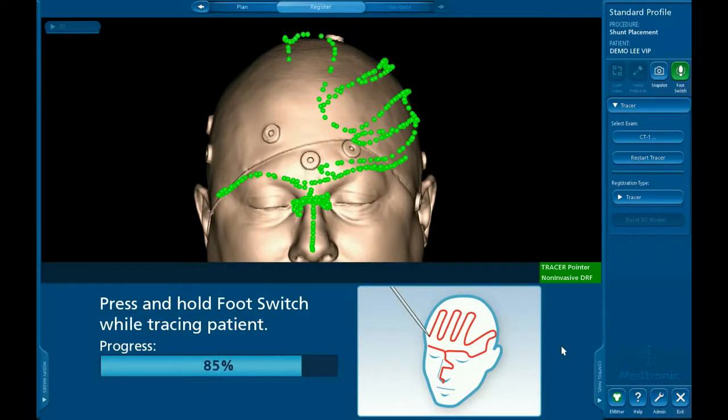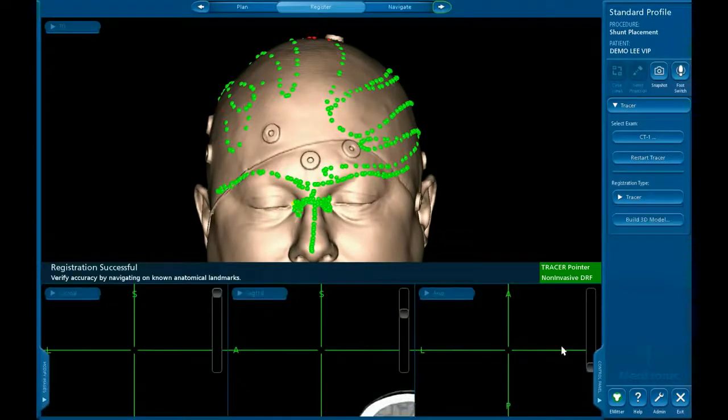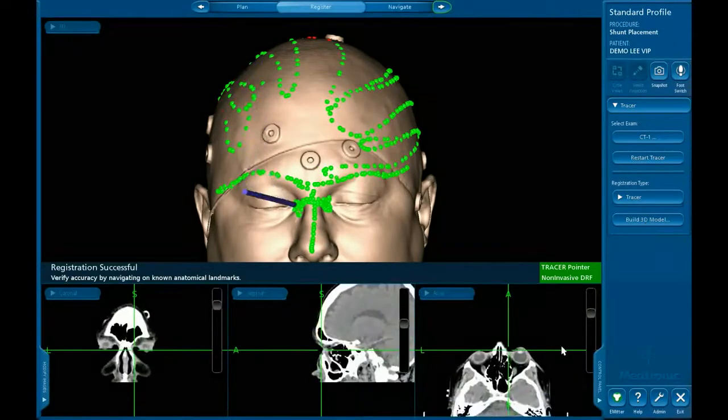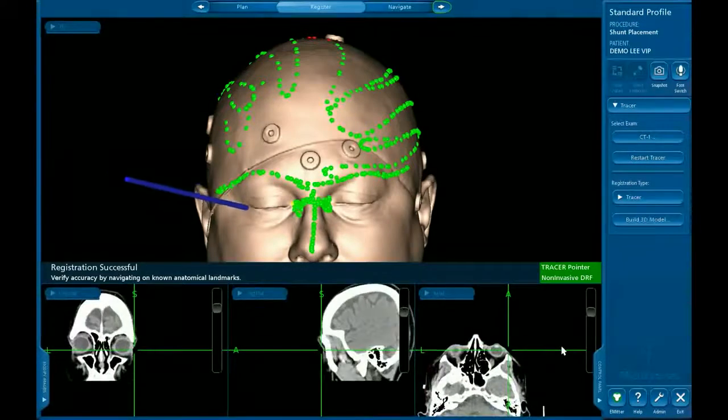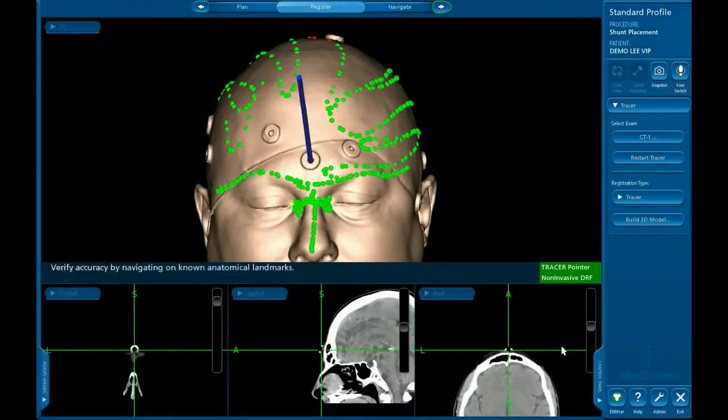Pushing too hard can displace a fiducial or lead to a tracer pattern that doesn't map to the scalp surface in the scan as closely as possible. Using a light touch will ensure the best patient registration possible. A good registration technique is crucial to ensuring the best possible accuracy.